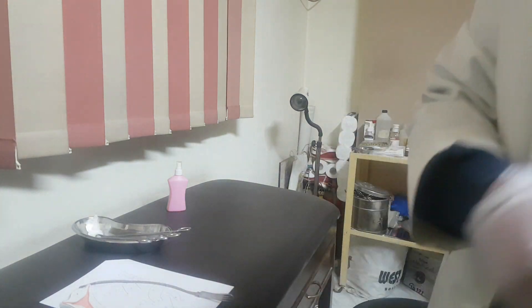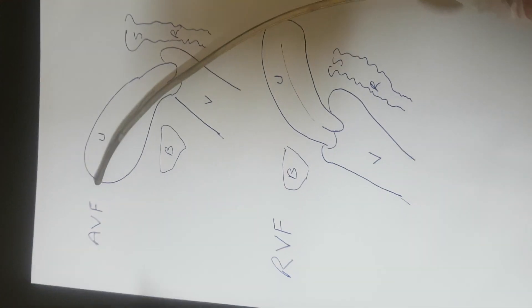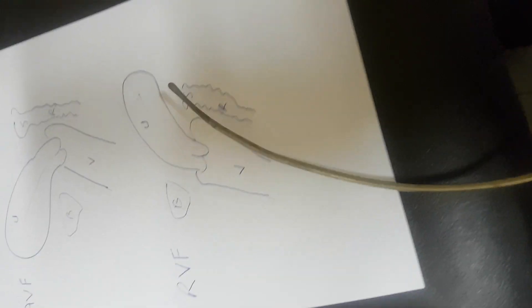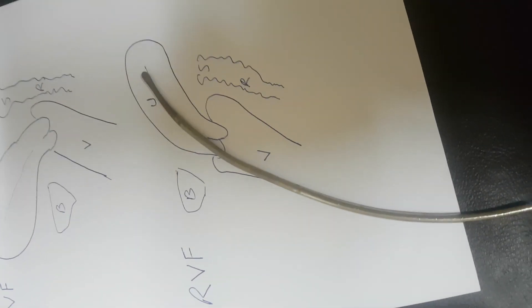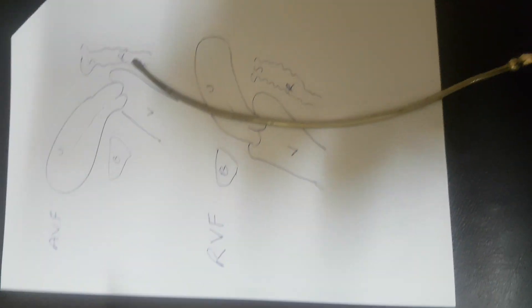So now we have finished our skill today. I hope it was good enough. Have a look from nearby — this is the AVF uterus, and this is the RVF uterus, and the sound should be directed like that. Have a nice day everybody.